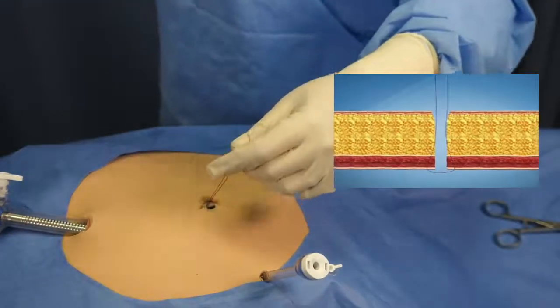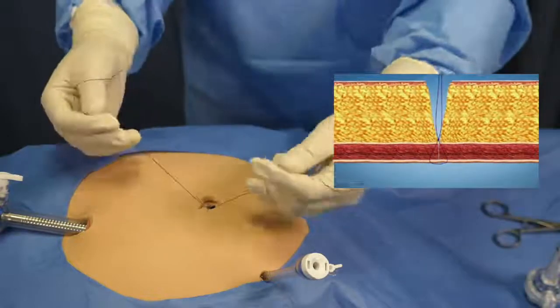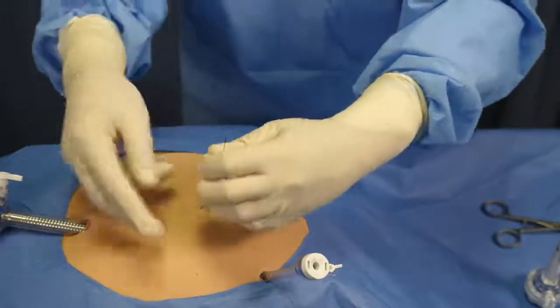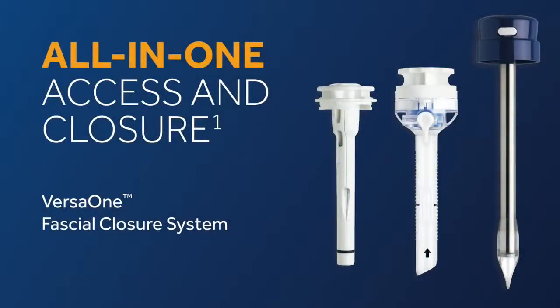Remove the trocar assembly. Tie a knot to close the fascia. That's the VersaOne Fascial Closure System — an all-in-one and easy-to-use port site closure system.